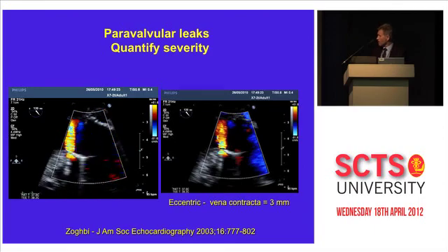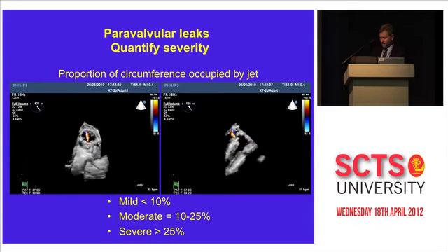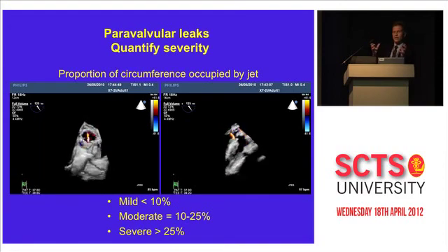And the vena contracta, 3 millimeters, so it is certainly not hemodynamically significant. With 3D, it demonstrates very nicely from the anterior side here, just where your right coronary artery comes off, diagonally across the outflow tract, and the same. So, how can we quantify that?